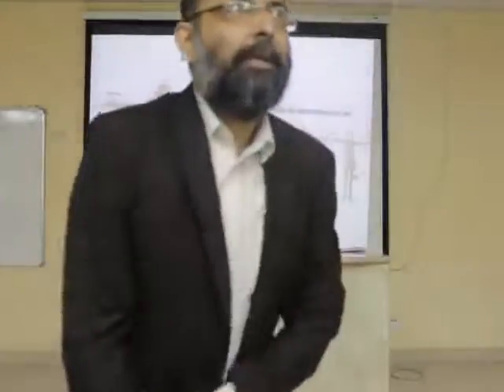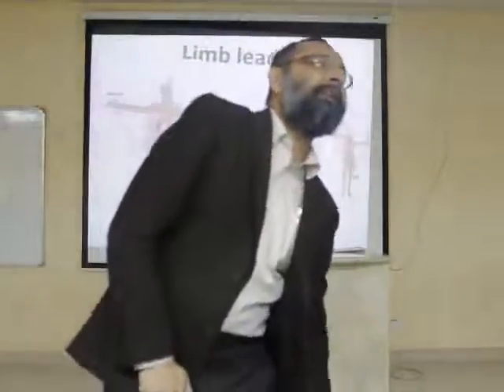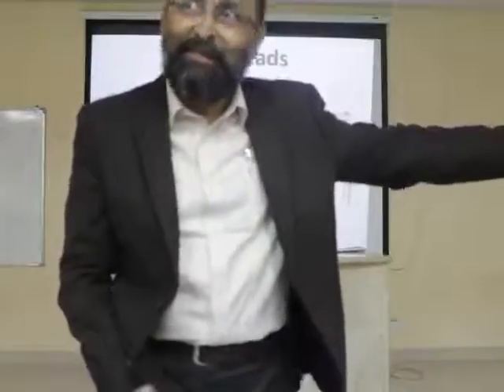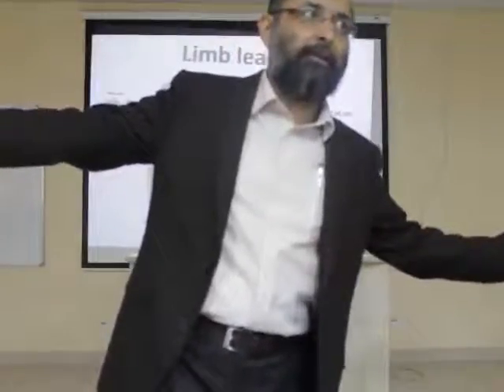Now just observe and see what is special about the right arm. Both negative. What is special about the left leg? And what is different about the left arm? One positive and one negative, isn't it? In one system it's positive and in another it's negative. So right arm is always negative. True or false? True.